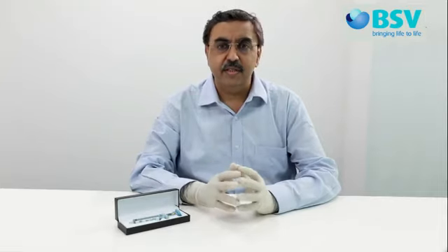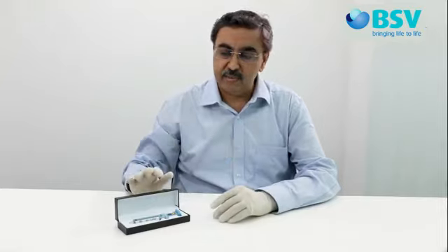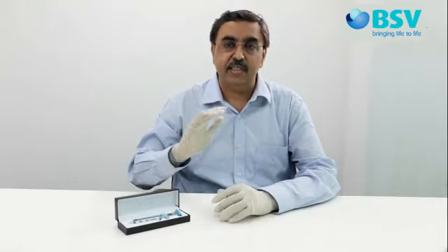Any device used in your practice should be calibrated to give an accurate reading. However, as observed with all devices, there may be a need to calibrate this device before using it. Unlike analog manometer devices which have to be sent to the manufacturer for calibration, you can calibrate AG Cuffil very easily within a few seconds.